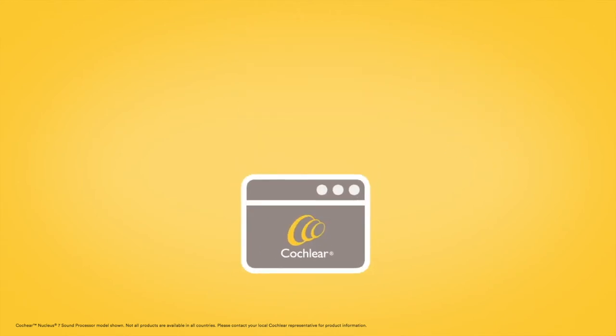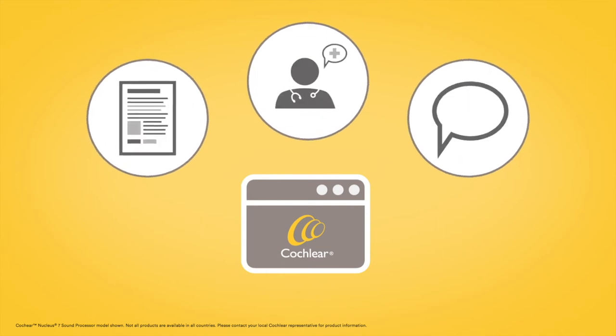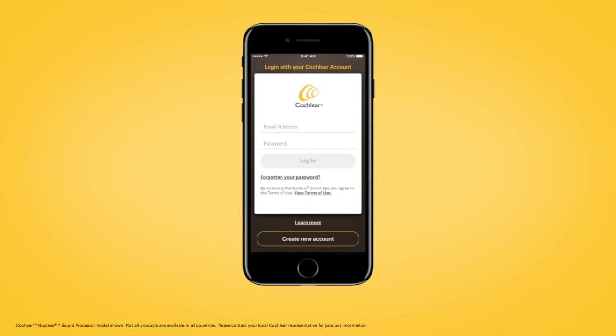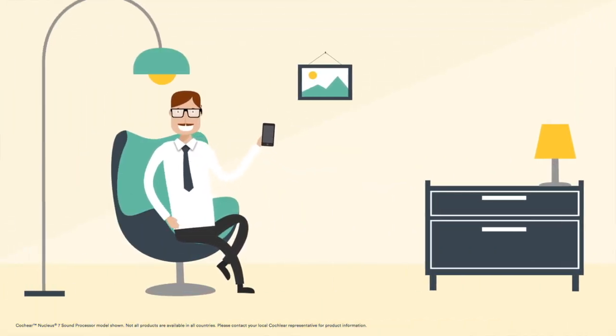If you've purchased a Cochlear product from the online store, or have used a Cochlear online service in the past, you may already have a Cochlear account. If you do not already have a Cochlear account, tap Create New Account, then follow the instructions in the Nucleus Smart App to set up your Cochlear account.